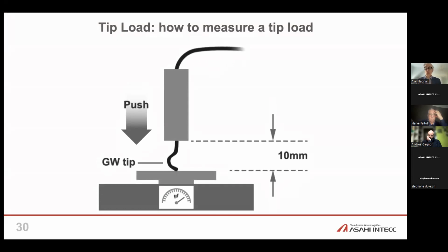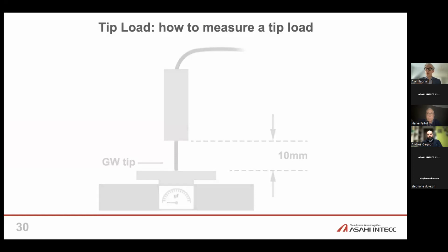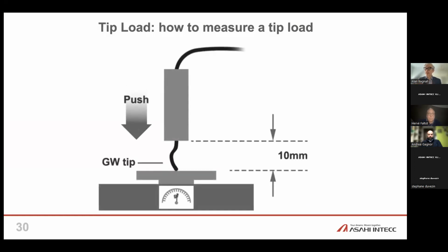Putting that into a practical perspective, when you're performing an angioplasty procedure and you're moving your wire down a vessel, if you see the tip buckle over on a 1 gram wire, you're exerting more than 1 gram of force at that tip. If you took a wire with a 12 gram tip load, it wouldn't bend over like that. You would have to be exerting more than 12 grams of force for it to bend over.